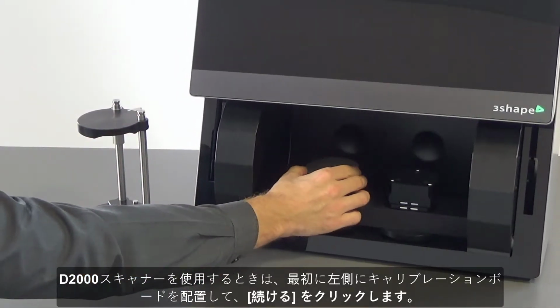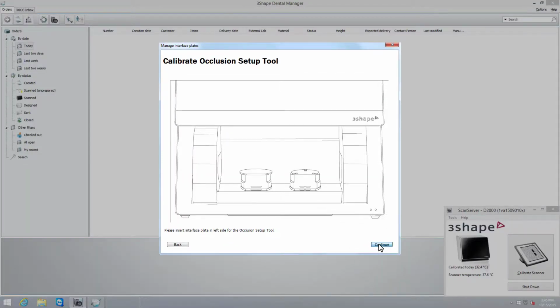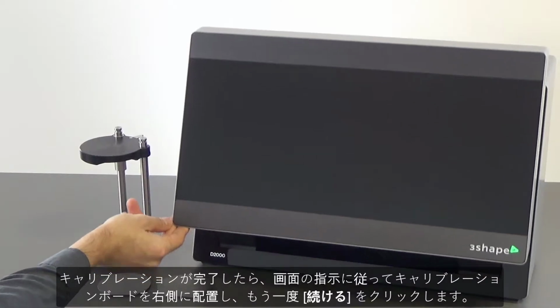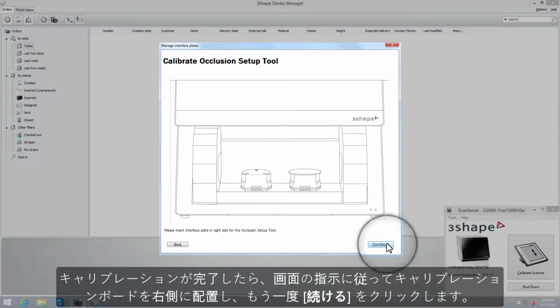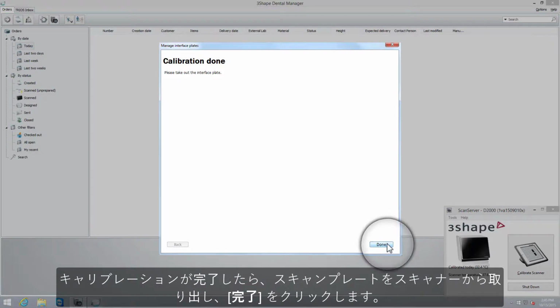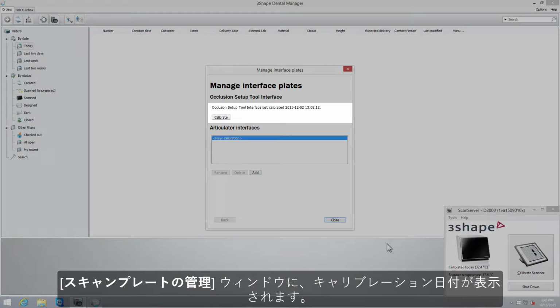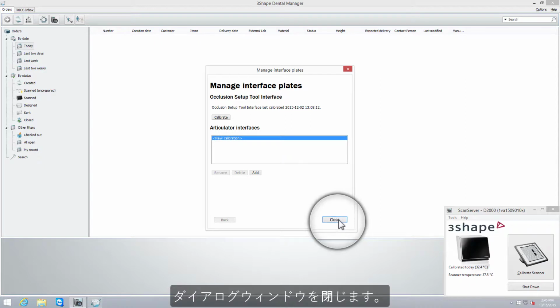When using the D2000, first set the calibration plate on the left side and click Continue. When calibration has finished, move it to the right side according to the dialog window, and click Continue again. Once calibration has finished, take the interface plate out of the scanner and click Done. In the Manage Interface Plates window, a new calibration date will be visible. Calibration must be done once, but we recommend recalibration if the scanner has been moved. Now you can close the dialog windows.